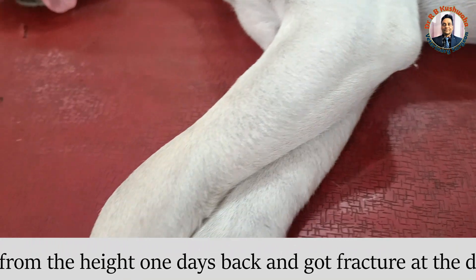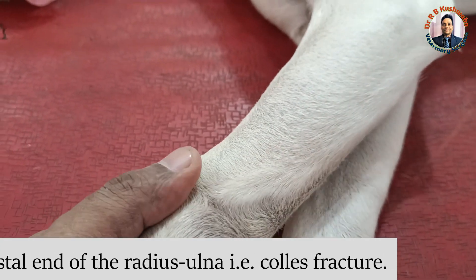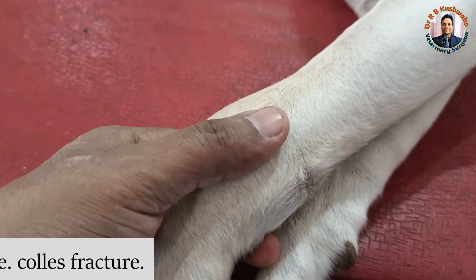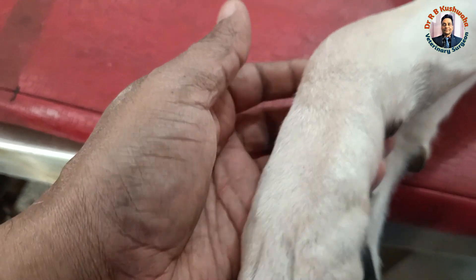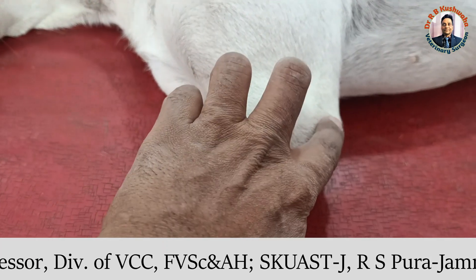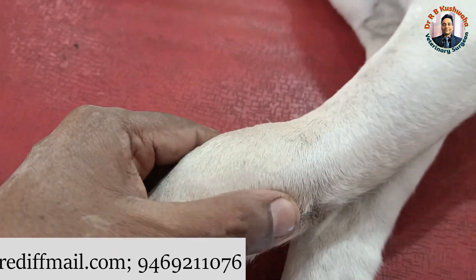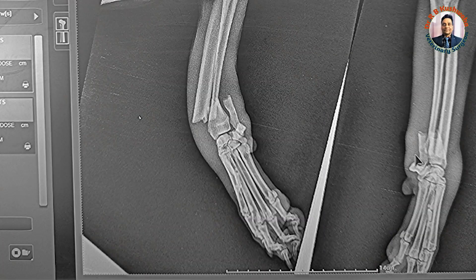This animal fell down yesterday from a height and got this fracture. If you see here, this is the carpal joint, this one is the elbow, and this is the radius-ulna. You can see swelling here and there is abnormal movement. Upon radiography, we found that the fracture is at the distal one-third of the radius-ulna with overriding.